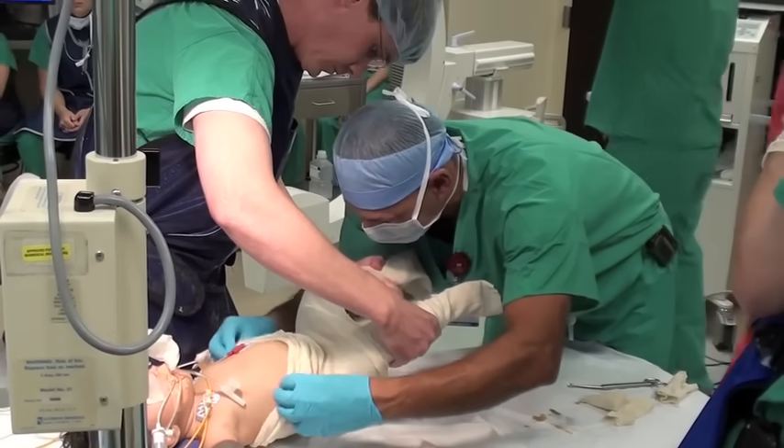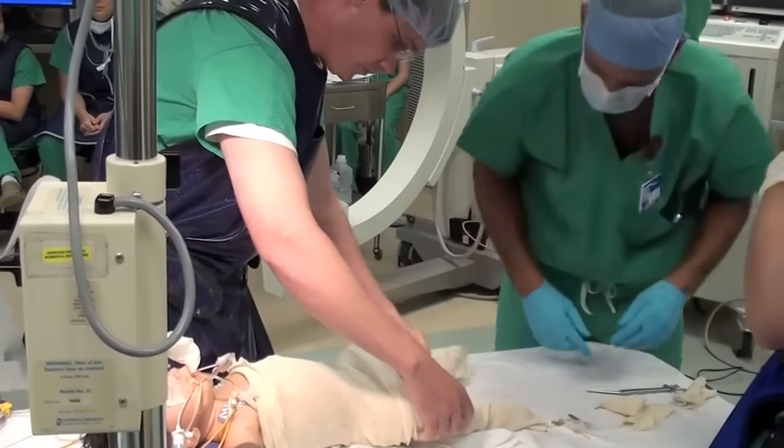This is a video of putting on a cast, a body cast on a child that we call a spica cast.